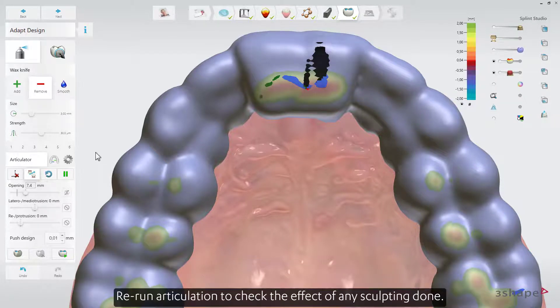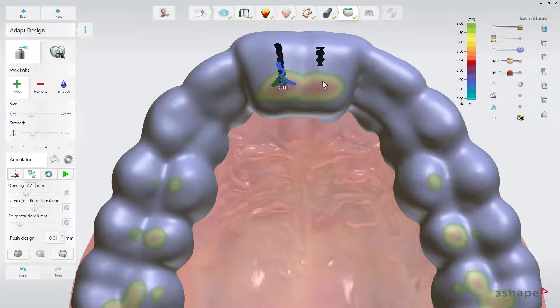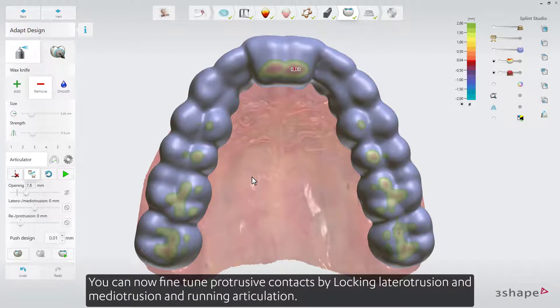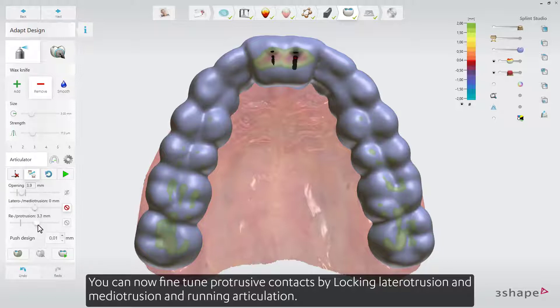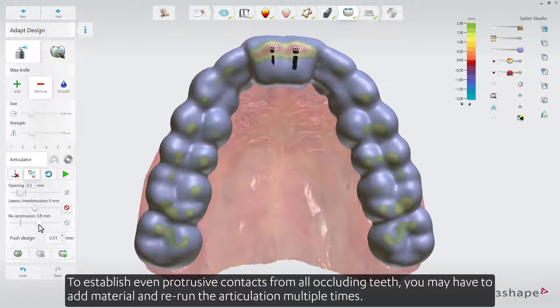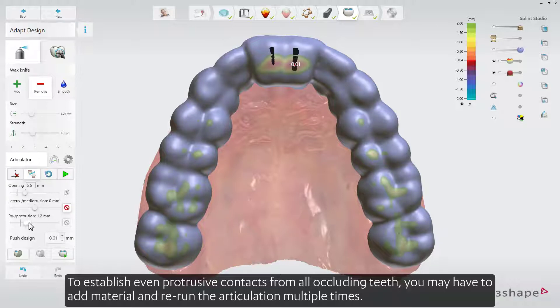Rerun Articulation to check the effect of any sculpting done. You can then fine-tune protrusive contacts by locking Laterotrusion and Mediotrusion and running Articulation. To establish even protrusive contacts from all occluding teeth, you may have to add material and re-run the articulation multiple times.